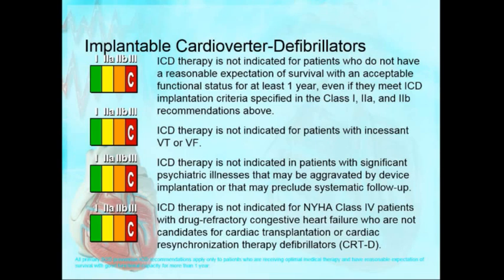An easy way to think about it: if you put in a pacemaker, not many people are monitoring the pacemaker guidelines. ICD guidelines are very strict. Medicare, everybody's following it, because the equipment itself is a good 20 grand difference between an ICD and a pacemaker. With the equipment, the implantation technique, everything added together, it could be a matter of $10,000 versus $50,000.